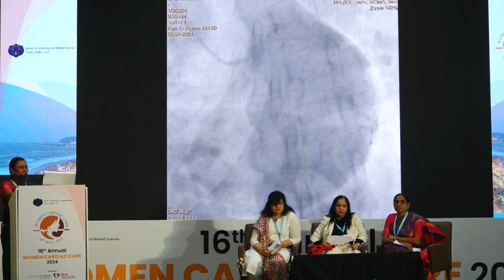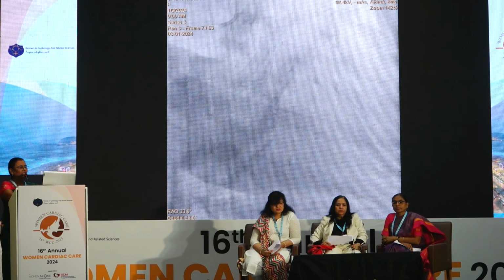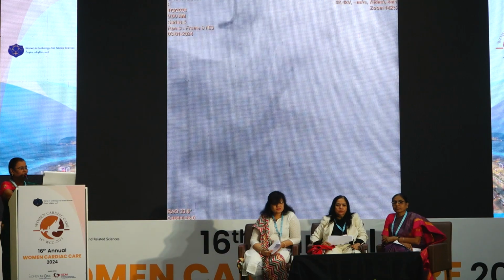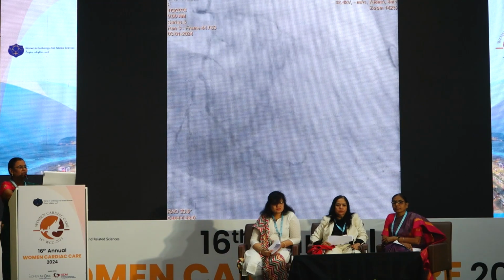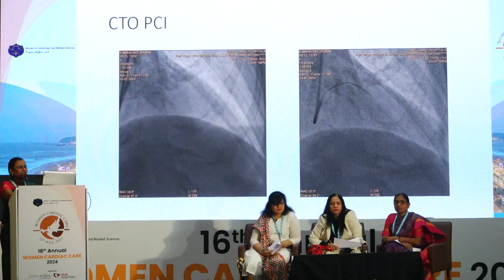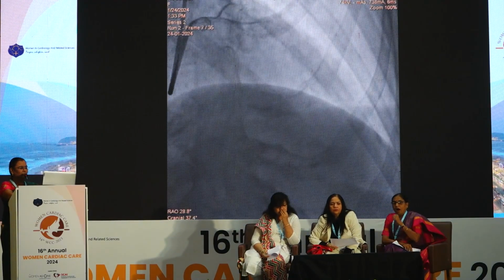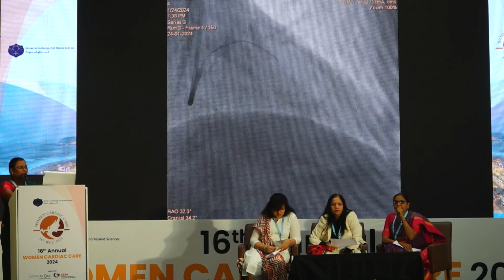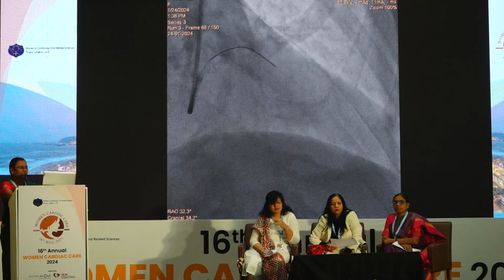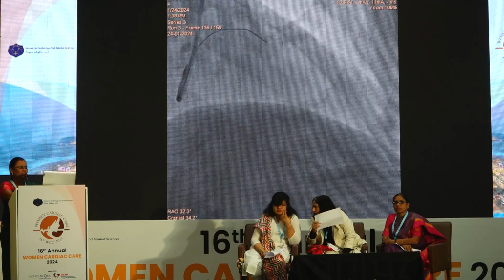Going to the angiogram, the left main is normal and there is a LAD total cut in the mid LAD, and the right coronary system is normal. So it is a single vessel disease with a LAD total cut. We wanted to proceed with the CTO PCI and we started with the regular approach with a 0.014 wire with a balloon support.